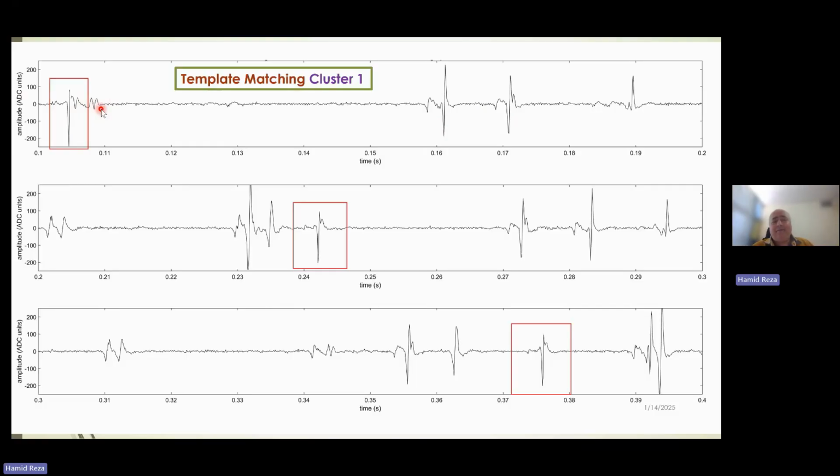And then I have the activity of some units together, then these large ones will overlap these ones, and I'm not able to identify this. In other words, when the amplitude of the active parts is similar to the background noise, I prefer to start decomposition with those that have higher SNR.